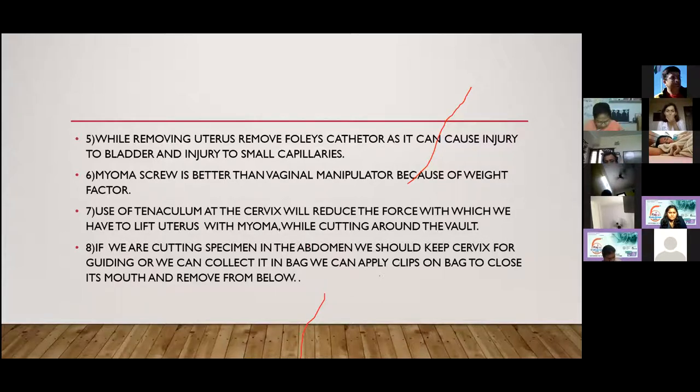One important tip: always remove the Foley's catheter because the bulb can cause injury to bladder vessels and capillaries, and can even cause avulsion of the bladder.